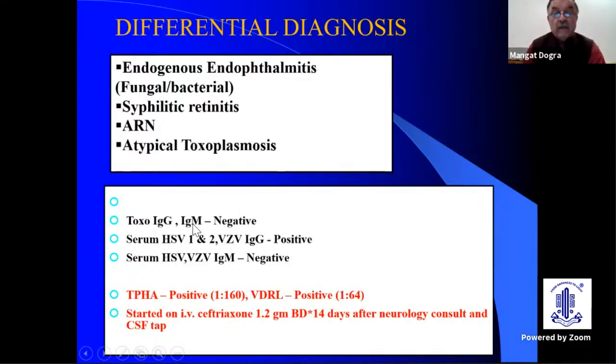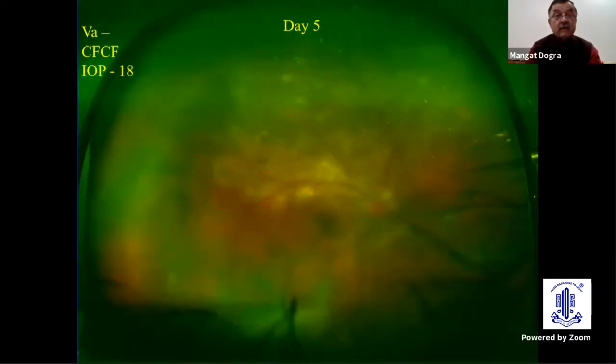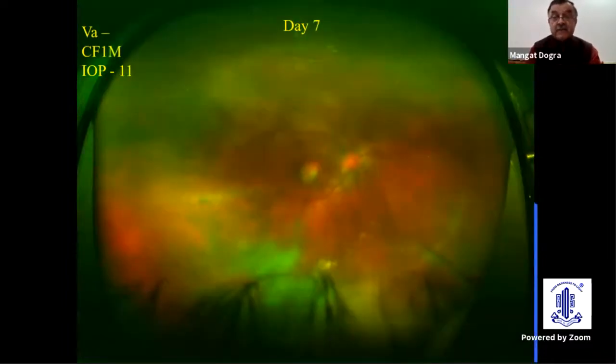Looking at all this, toxo as well as serum HSV were tested, but what was important here is that this turned out to be syphilitic. TPHA was positive, and so was VDRL, and the patient was started on intravenous ceftriaxone 1.2 gram twice a day for 14 days after neurology consultation. This is day 5 after the vitrectomy was done because of the confusion in the diagnosis, and you can see the lesions have started disappearing. Then this is day 7. Subsequently the lesions resolved and he started seeing better, but I'm not showing the whole story.